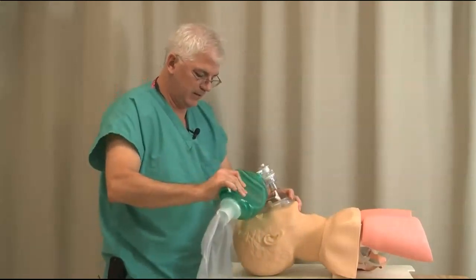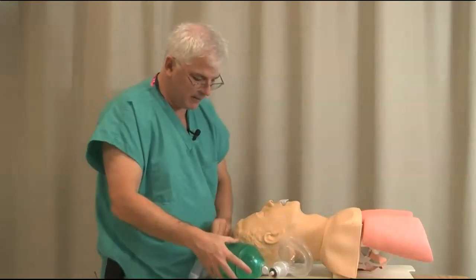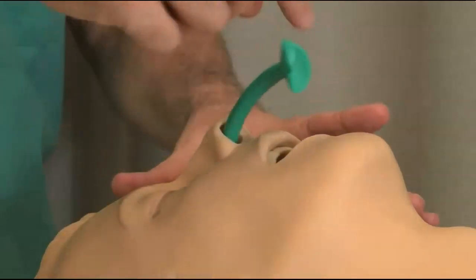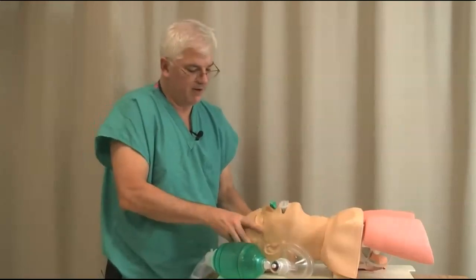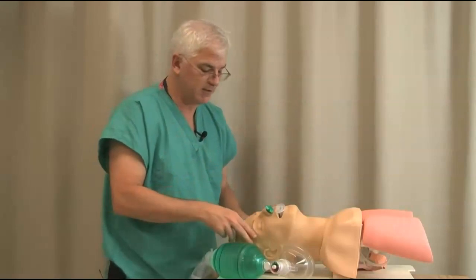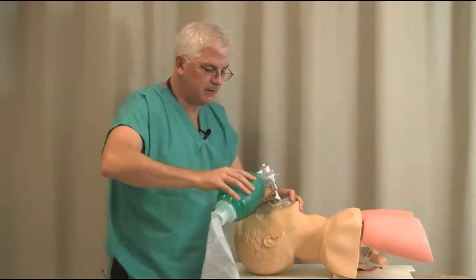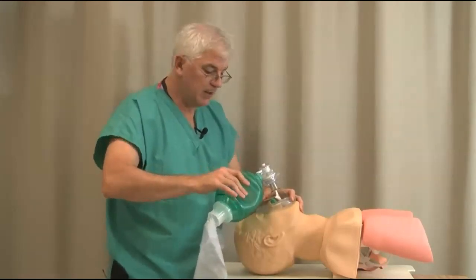And you mask away. Another thing that helps a lot of times when people have a lot of soft tissue caving in, say an OSA patient or a patient with a big BMI, is a nasal airway. Be very aware of the fact that this can cause a nosebleed. So, patients on Plavix, you're going to think twice about this. But with these adjuvants in, you should be able to mask the patient.